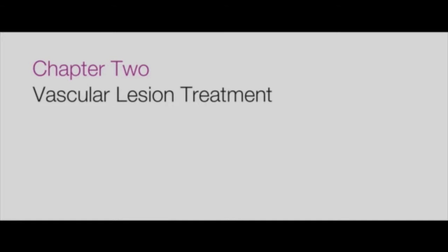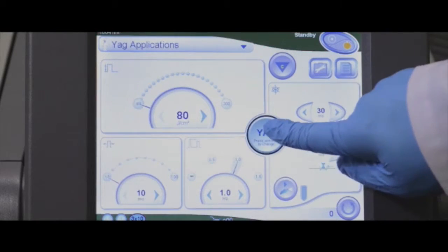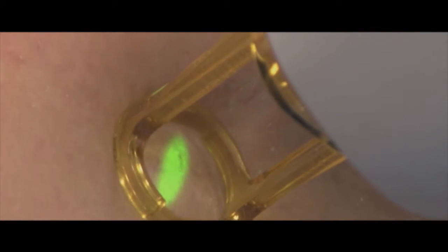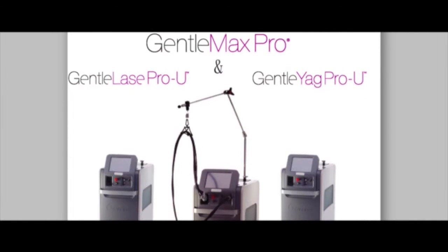Chapter 2. Vascular Lesion Treatment. Vascular lesion treatments can be accomplished with the 755 nanometer wavelength and the 1064 nanometer wavelength. See the clinical manual for a complete explanation of indications and suggested settings.